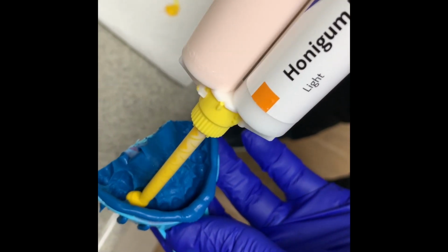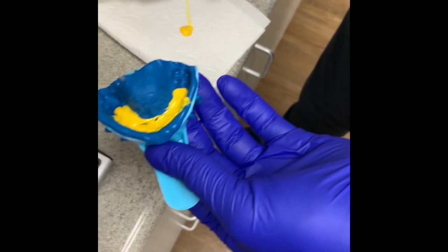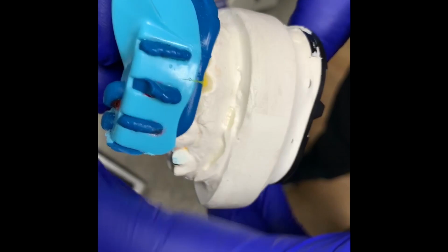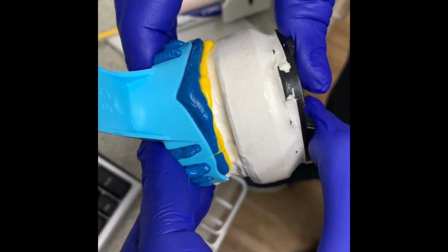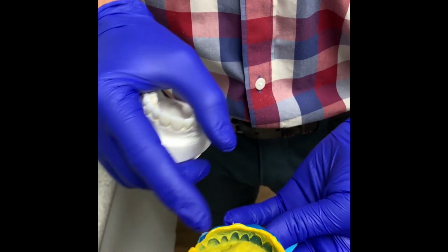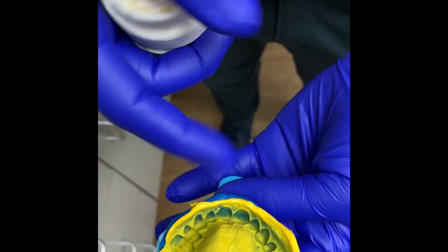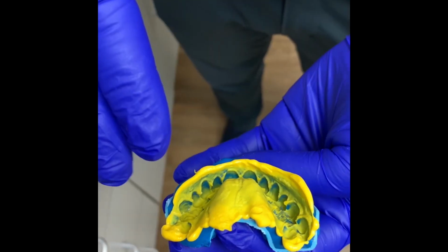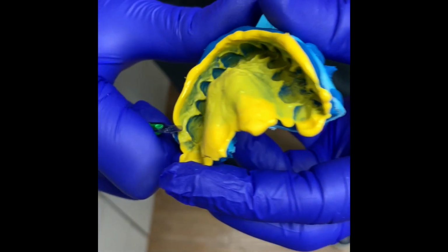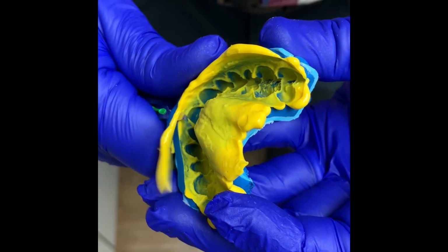We're just going to try and capture a little bit more detail on these teeth. So I'll fill the tray, and then I'll seat it again on our previously Vaselined cast. We'll seat it fully and let that set for the appropriate time. All right, so now we've separated, and you can see that our light body filling material filled in there real nicely. It's separated real nicely, and we've captured all of the discrepancies that we had in the previous impression. The final step is I like to take a little 15 blade and trim off the excess, being careful not to hit the margins.